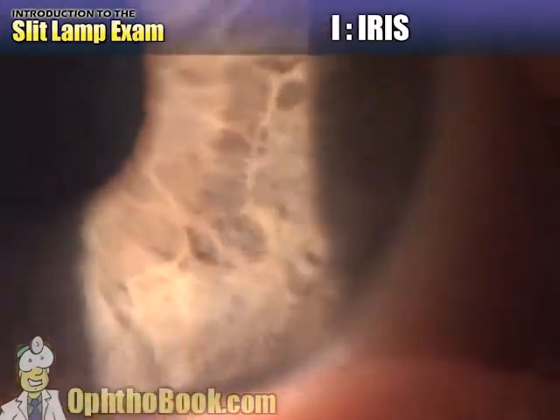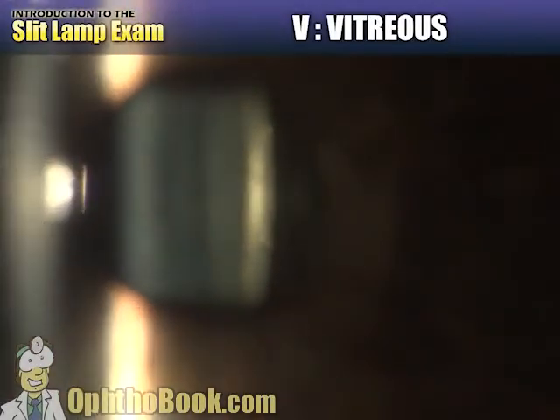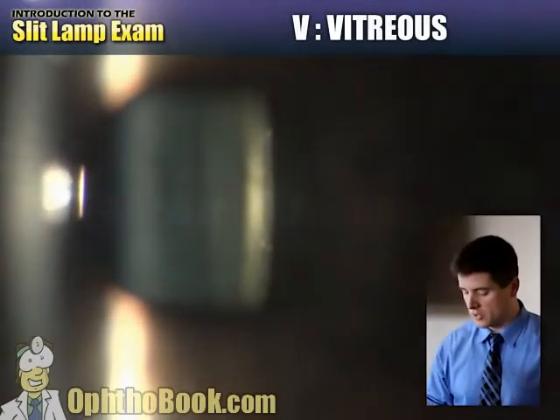And the iris, of course, is the easiest part to look at. You can even bump your magnification up if you want, but not a whole lot of pathology usually on the iris. Looking at our lens, once again, we make a very thin slit beam so we can look at this clear structure. And if we look here, we can actually see the front and the back of the lens, and behind that is the vitreous, which just looks like a dark cavity back there unless there's other issues.